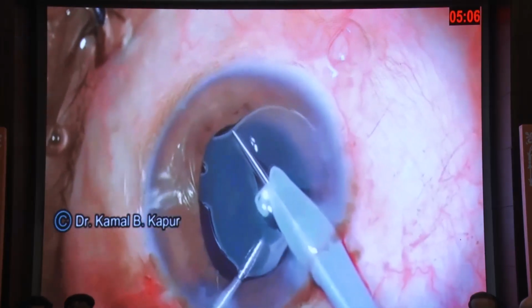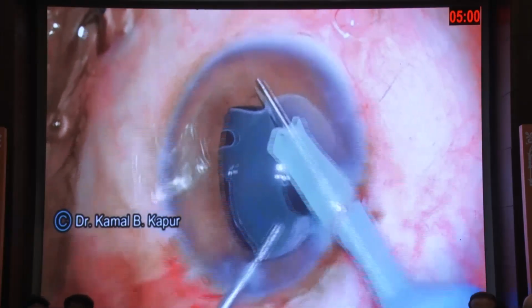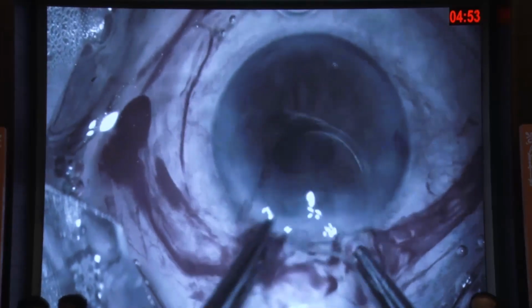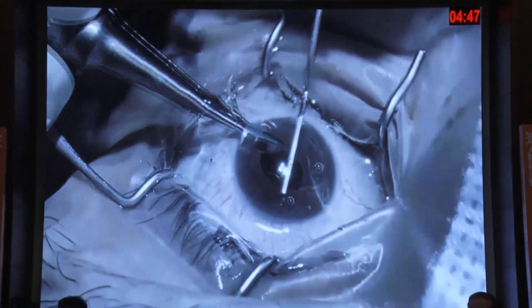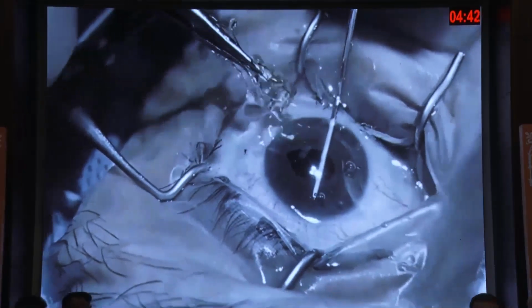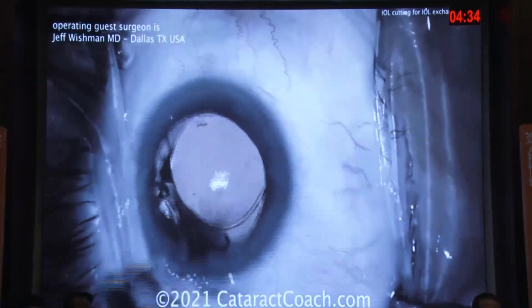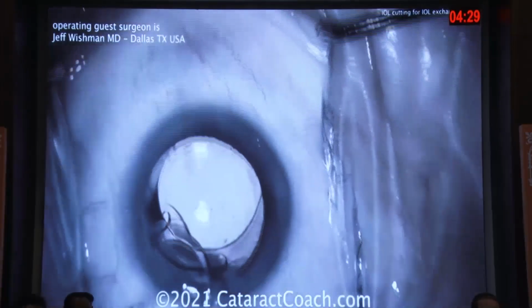Here the lens was bisected at the optic, and the optic haptic junction was also cut and thereby removed through a 3 mm incision. The older methods to remove IOLs were either extending the incision or the twist and out technique, which is a very nice technique. However, the surgeon has to be skilled and very quick in doing the procedure. Also, sometimes in case of a posterior capsular rent, it is not advised. The oldest fashion is to bisect the lens with scissors into 2 parts and then remove it through a 3.2 mm incision.